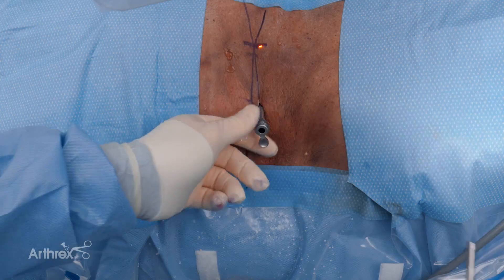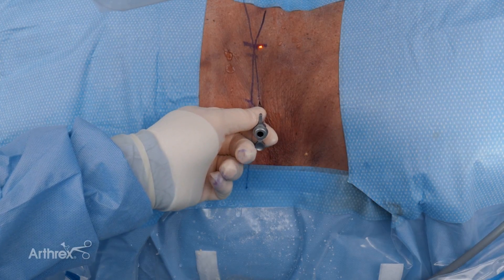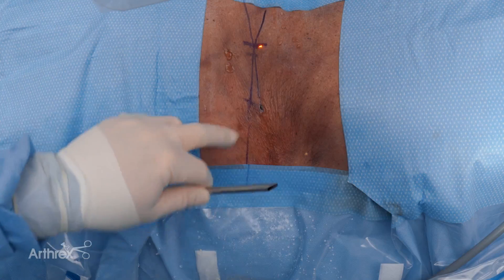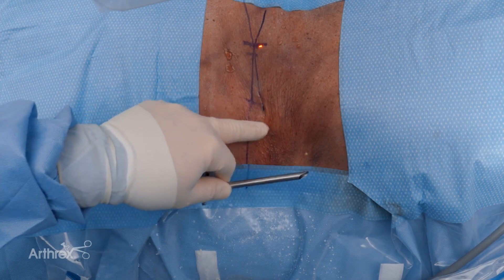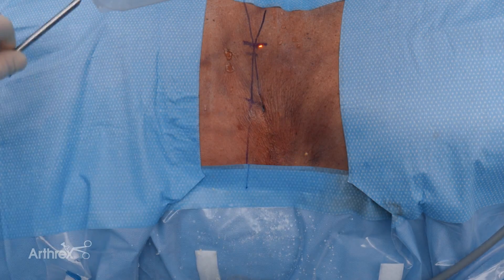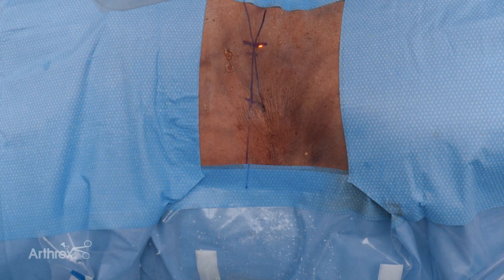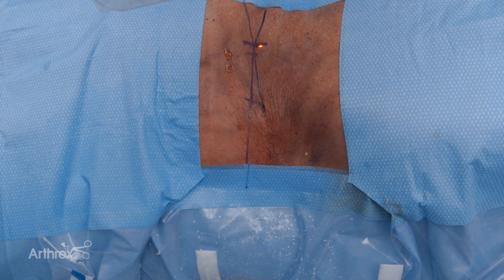At this point, you remove the scope and remove the cannula. Typically, do one subcuticular stitch in the subcutaneous skin and a dermabond. The patients can shower the day of surgery and they go home without narcotics.